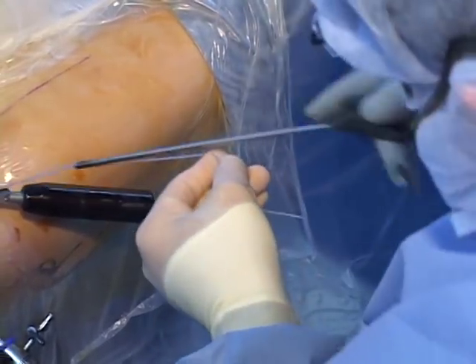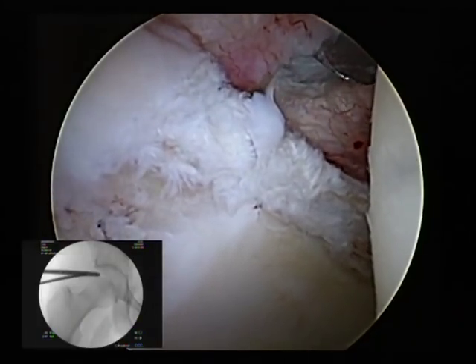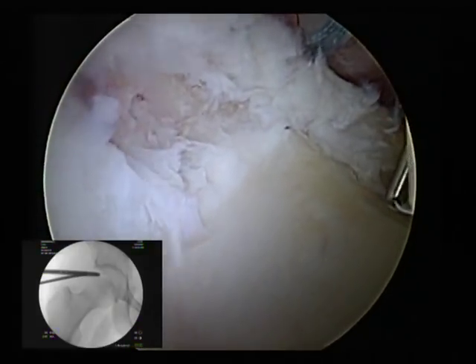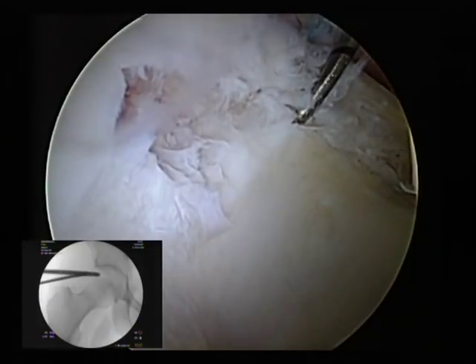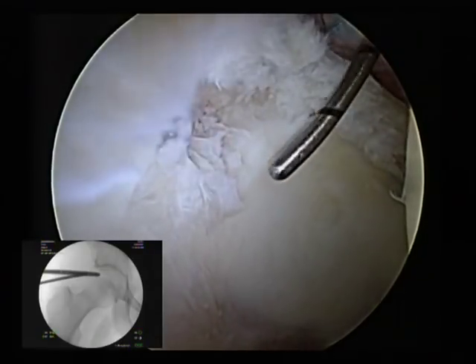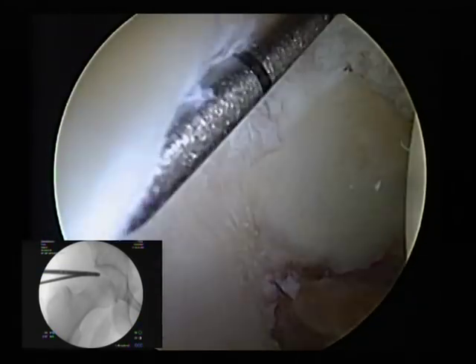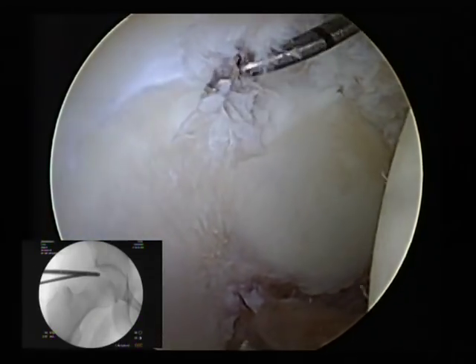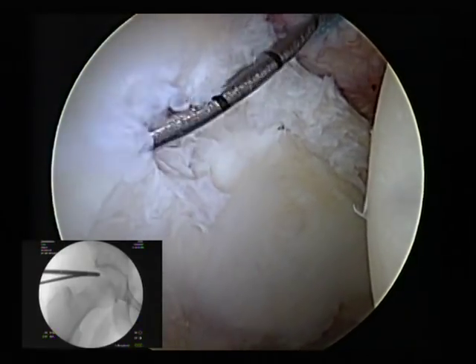We're going to use the long fiber wire cutter, slide right up to our knot, and cut it. Now we have no knot and no mechanical irritation with any part of the device. The completed repair shows that our anchor insertion is immediately behind the center point where I wanted to put it. Our labrum is tucked back away from the joint — there's still a good amount of labrum here. There's a little bit of early fraying but no detachment. Here's our chondroplasty, and there's a nice stable interface everywhere. No significant delamination left behind, and the rest of the joint looks normal.